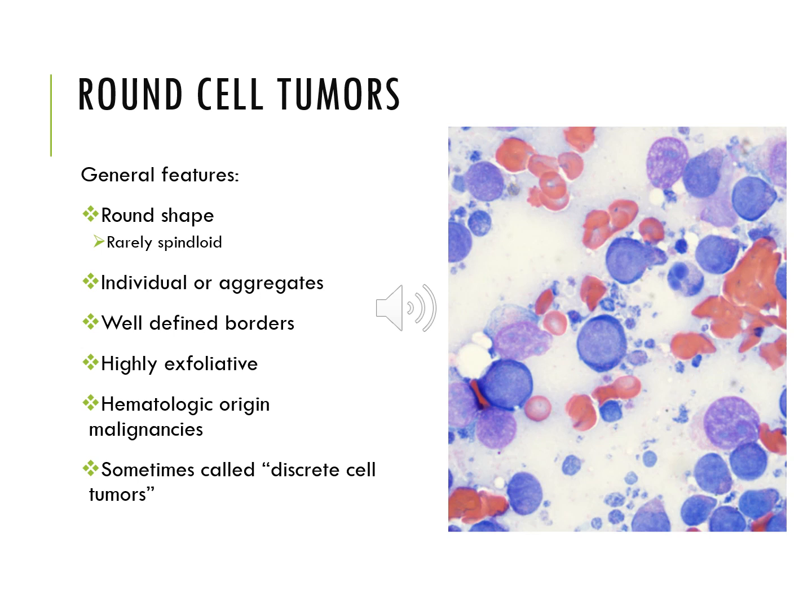They are usually found individually or in small aggregates. They're not usually cohesive is the difference. So they can be found in aggregates, but they're usually not adhered to one another like we see with epithelial cell tumors. So that's something to keep in mind.